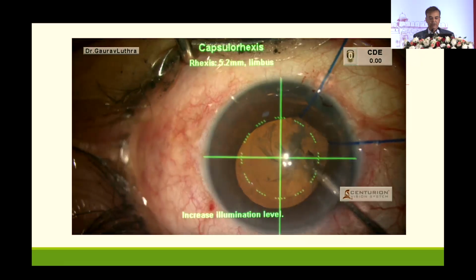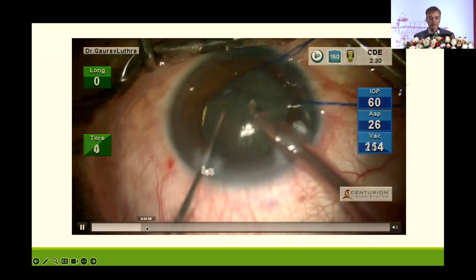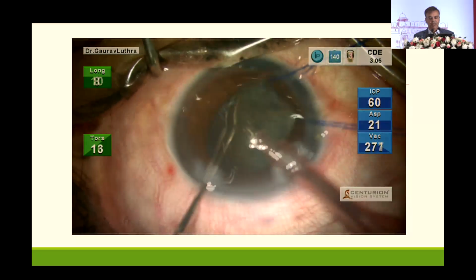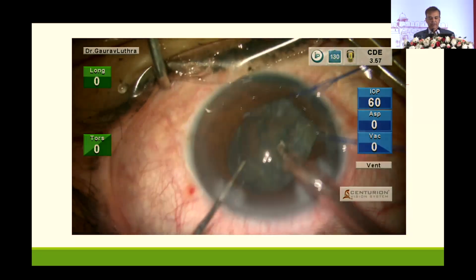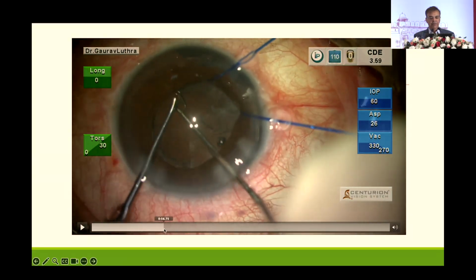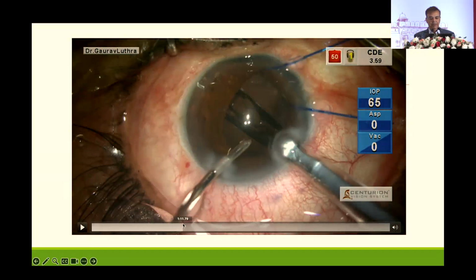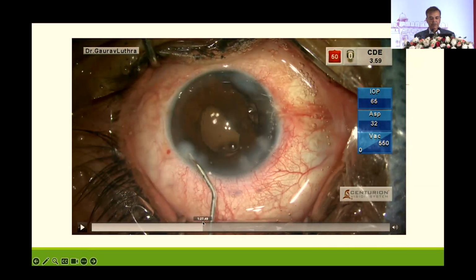So we didn't want to dissect the conjunctiva in that area. We decided to go with Hoffman pockets. I'll just show you how that is done, and it saves the conjunctiva also for patients who might need glaucoma surgery in the future. It's a great idea to conserve the conjunctiva. So Hoffman pockets in some situations work quite well. Once we put in a CTR to stabilize the bag and then put in the lens, now we have the task of doing the repair.